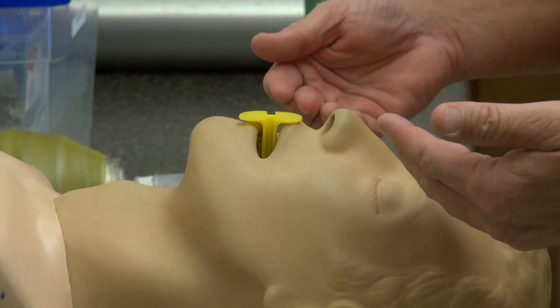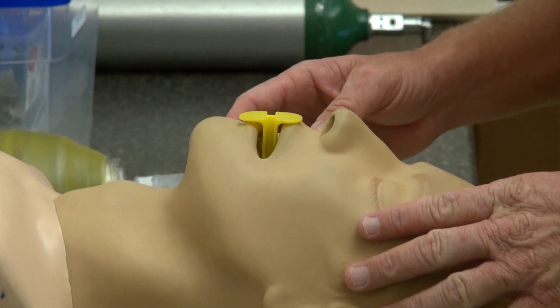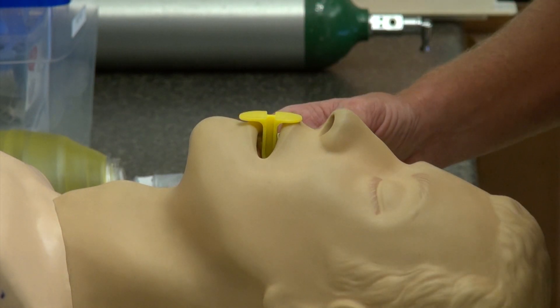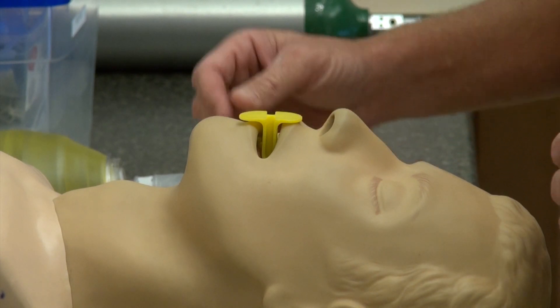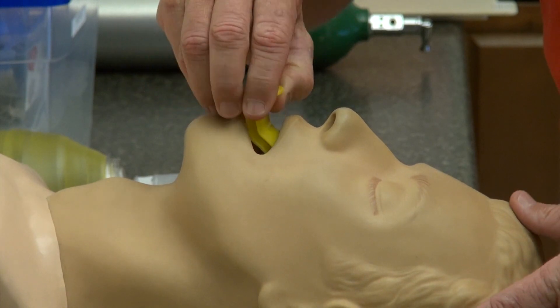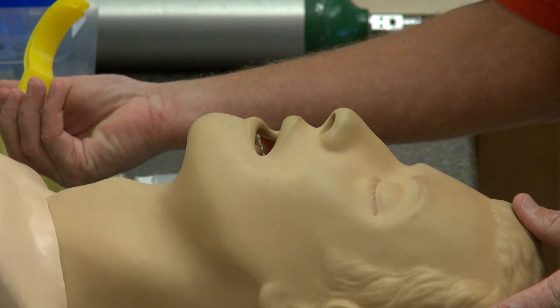Removal of the OPA when our patient no longer needs it or has developed a gag reflex is sometimes something that has to happen relatively quickly. As with any airway procedures, we prefer that you have suction at the ready for these instances. Typically it can be done by removing outward following the anatomical curve of the mandible, making that removal fairly quick and painless.